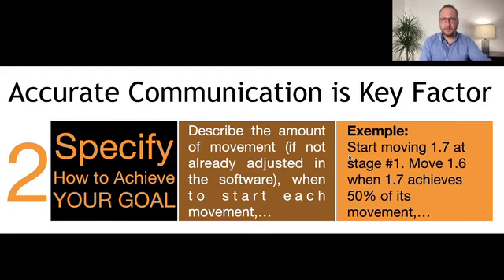Of course, this is going to take more time, okay? Or I can use another protocol. Depending on the situation, I like to use one or another, okay? So it's important to specify the amount of movement, because if you just say do sequential movements, the technician won't know. He won't know how much you want, and when he starts the order, he's going to do some average thing that he is going to do for all cases, okay?